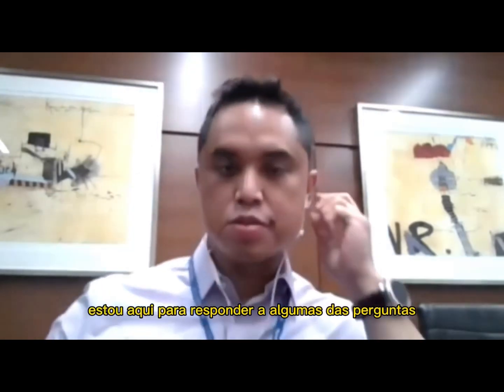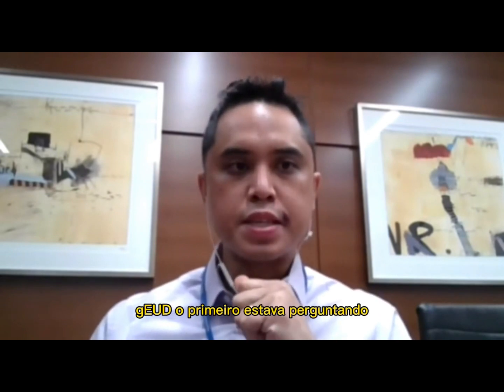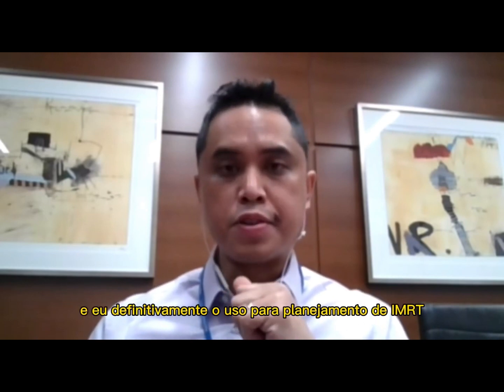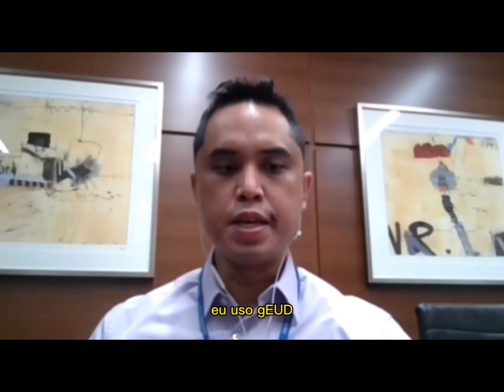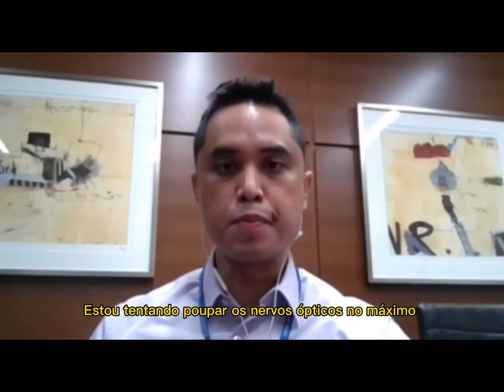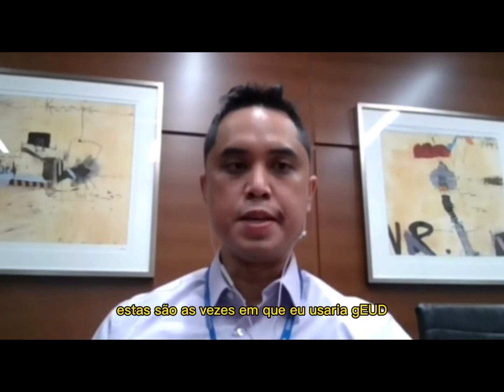Hi, everybody. I'm here to answer some of the questions that were given to me regarding my presentation on GEUD. The first one was asking, do I use it for all types of planning? I definitely use it for IMRT planning, GYN, prostate, brain, not too much on lung. But yes, for those types of cases, I do use GEUD. It helps out with the bladder, the rectum, trying to spare the optic nerve, so max point doses or optic chiasm, lacrimal glands. These are sometimes where I would use GEUD.